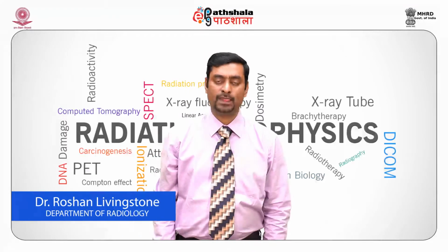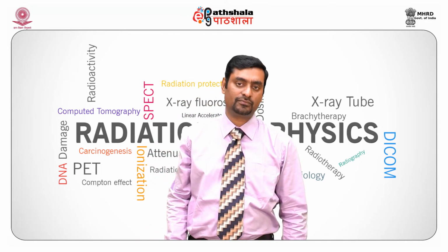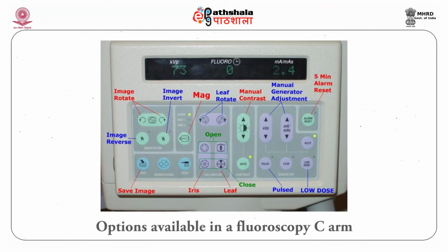this. When we enter into the operation theatres, we may see a fluoroscopic C-arm. These are small C-arms of the order of 8 mA to 11 mA. The options available as seen in this module is an image rotate, where one can rotate the image. Also, we can image reverse, or we can reverse the image, and we have the acquired images to be saved and to be sent to the picture archival communication system.